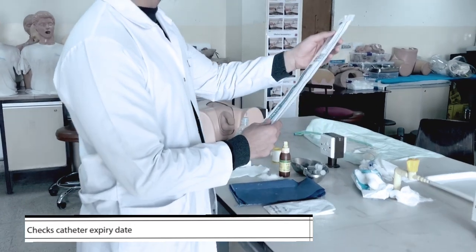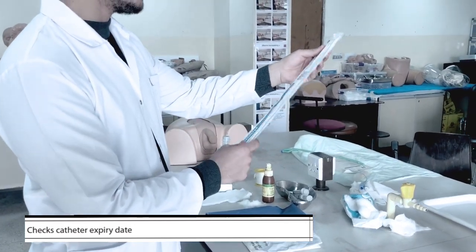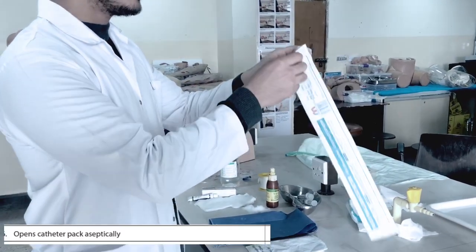Then we check the expiration date of the catheter. And then, open the catheter.